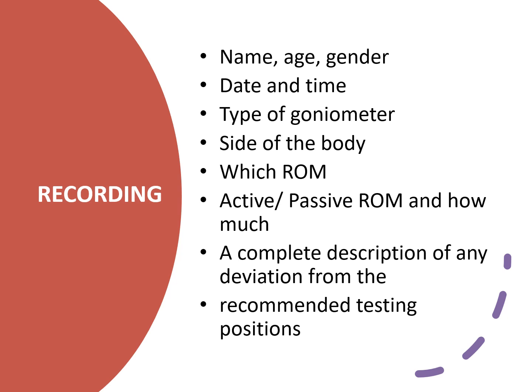So basically you have to write down flexion is so and so, extension is so much, abduction is so much, and so on. Then of course you have to mention whether it is active range of motion or passive range of motion. This is very important. You need to write down whether it is AROM or PROM.